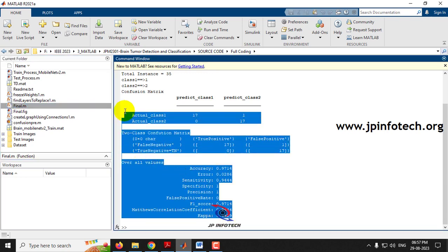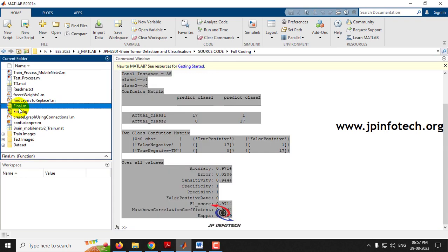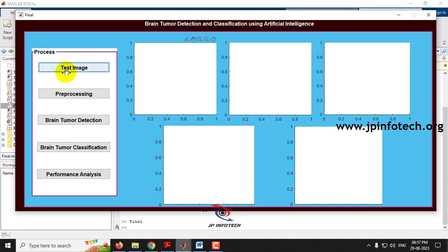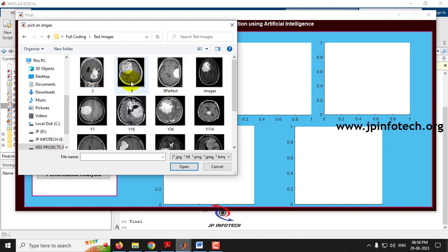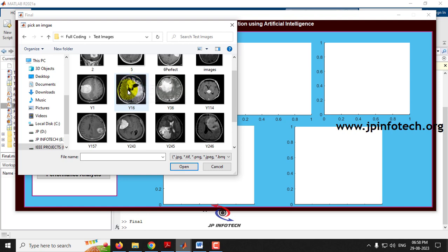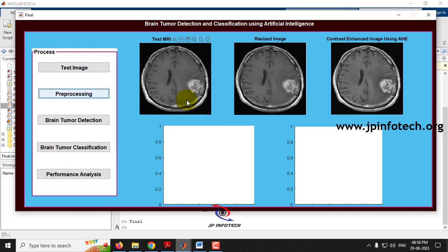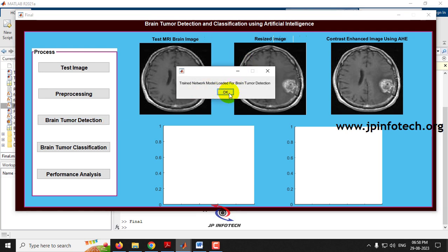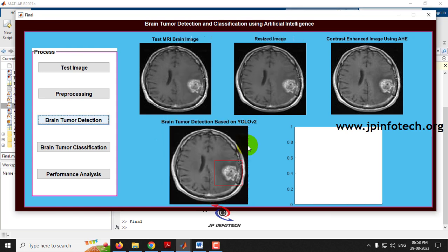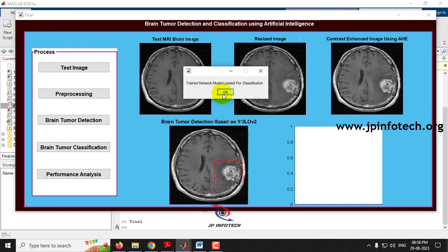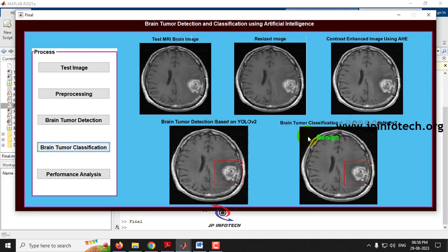Running the project again with a different test image: after pre-processing showing the resized and contrast-enhanced image, brain tumor detection is performed using YOLOv2. The trained model is loaded and the detection result is shown. This time, after clicking 'Brain Tumor Classification,' the result is classified as benign — the non-cancerous type.